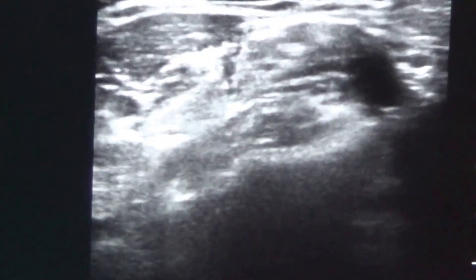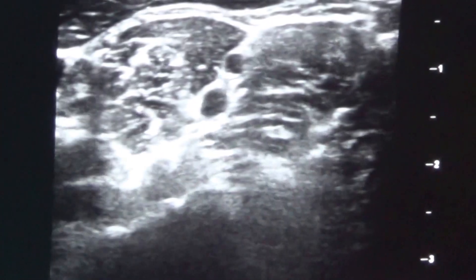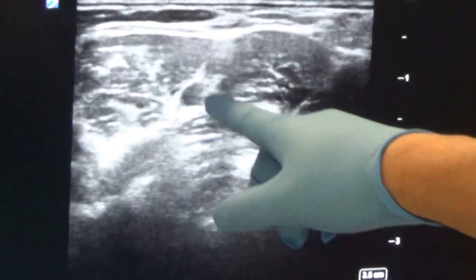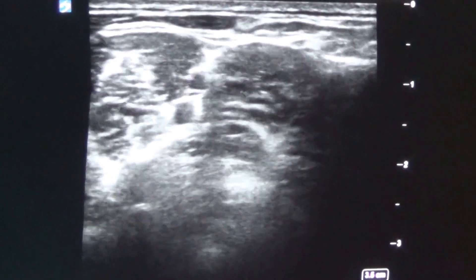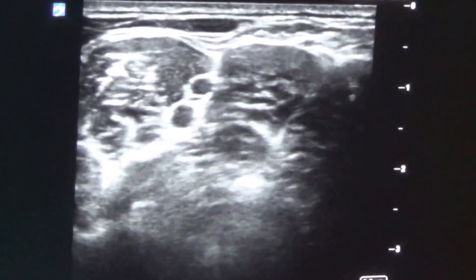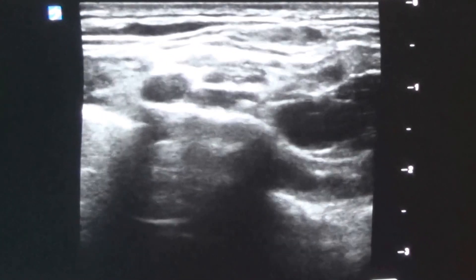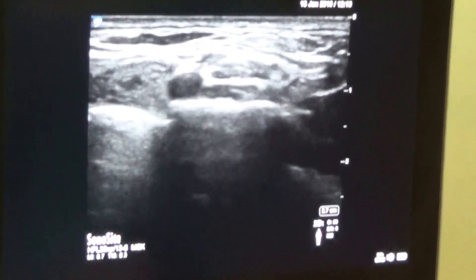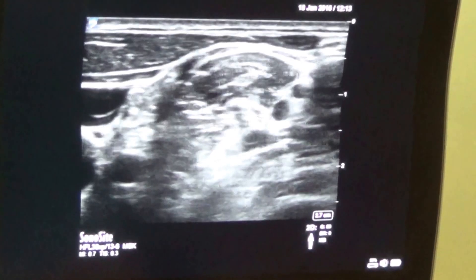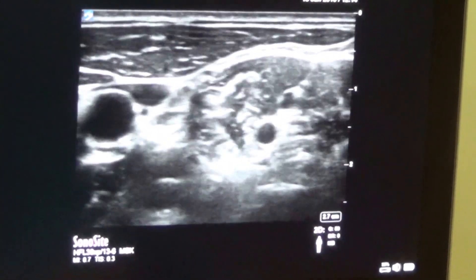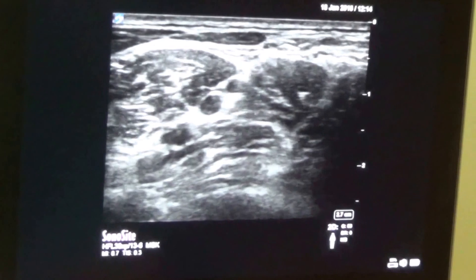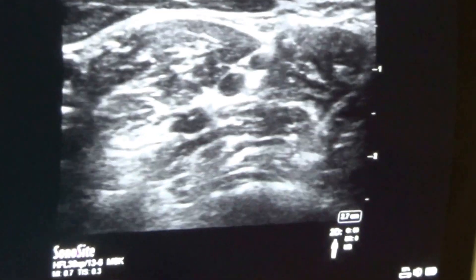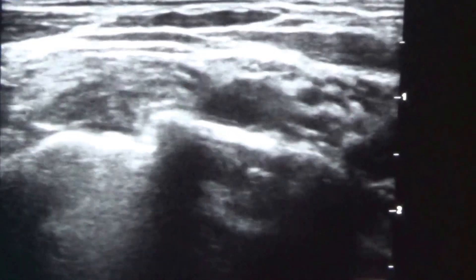In future videos we will discuss in detail exactly what structures you are puncturing, what layers are visible, how the needle comes in, and potential harm to the patient. If I decrease the depth on this thin patient, this is the supraclavicular area. We are talking about both nerve blocks — the interscalene with the three traffic lights is visible in the middle of the screen, and just nearby is the supraclavicular.